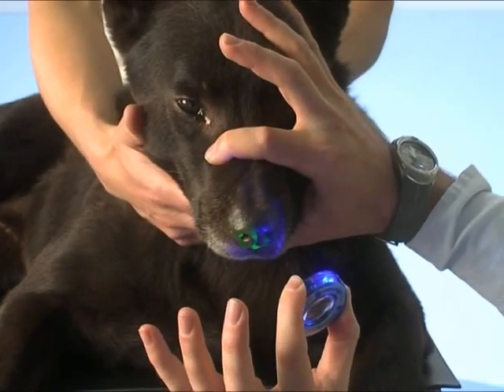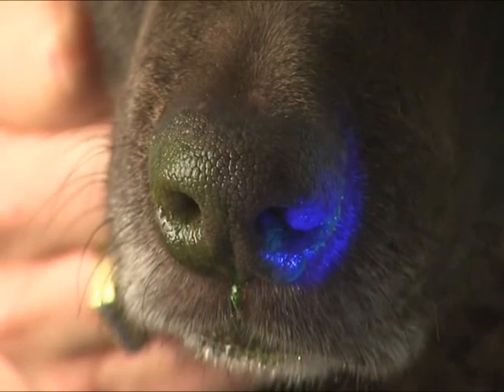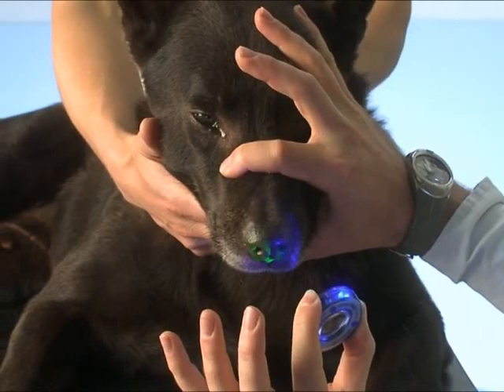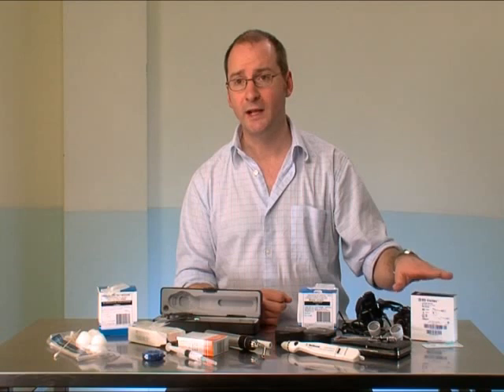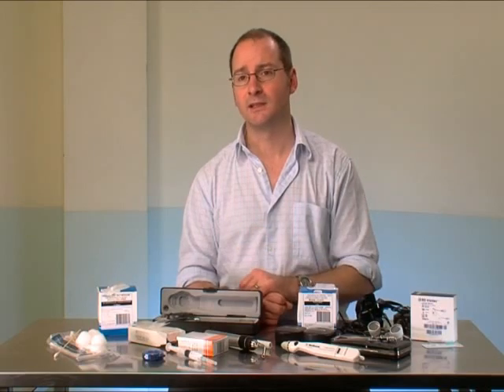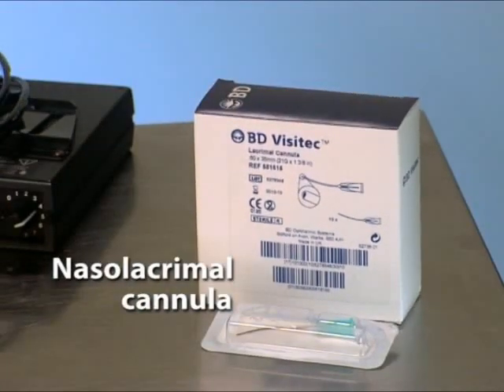Fluorescein can also be used to assess nasolacrimal patency. While this technique has some limitations, it can help to determine if further workup is needed. If you suspect an imperforate nasolacrimal punctum or poor drainage, then flushing the nasolacrimal ducts would be the next course of action, and you would need local anaesthetic for that and a nasolacrimal cannula.